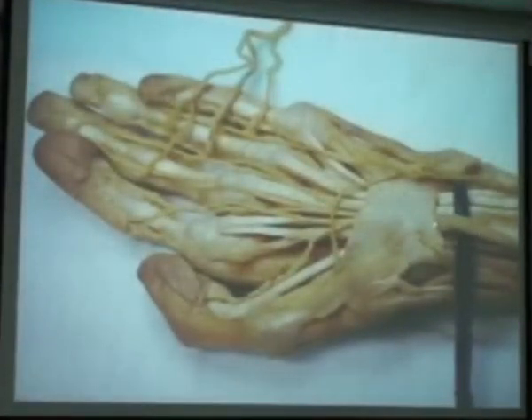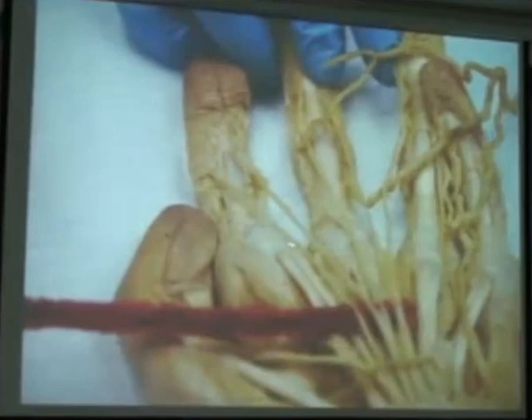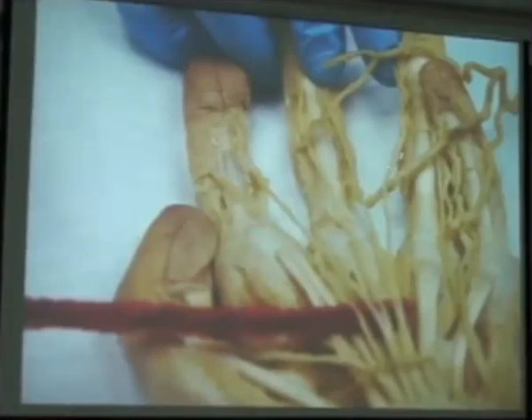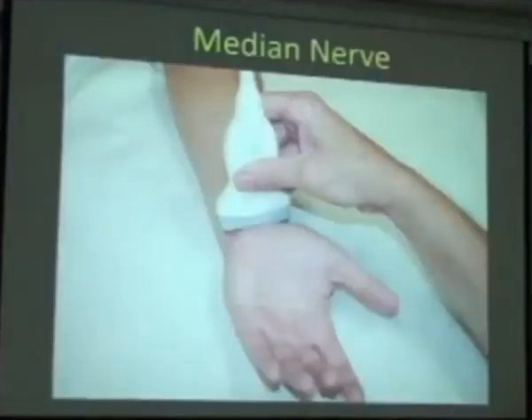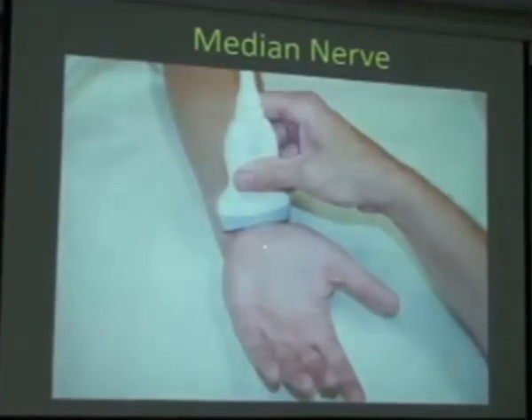You can see the nerve coming up and then passing deep underneath the retinaculum, going down to supply the fingers, including the thumb and adjacent fingers and the radial aspect of the ring finger. When imaging the median nerve, I get the patient to put their palm up. With the transducer just in the crease of the wrist, we scan a short distance before and after the retinaculum, assessing in both longitudinal and transverse planes.